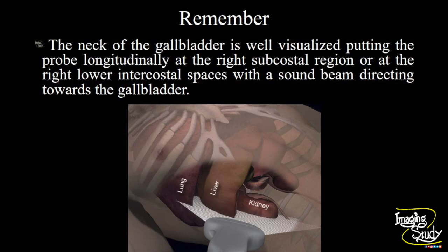Now the take-home message. The neck of the gallbladder is well visualized by putting the transducer longitudinally at the right subcostal region or at the right lower intercostal spaces with the sound beam directed towards the gallbladder. This is an excellent approach to see the neck of the gallbladder and you won't miss any stone at that point.